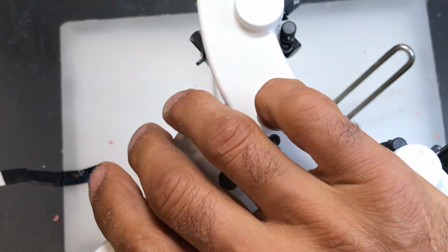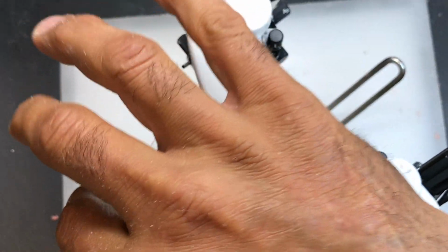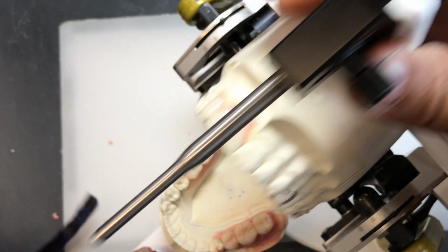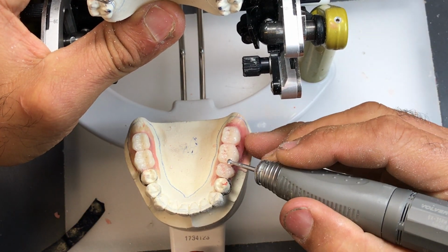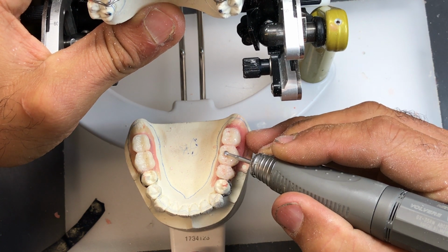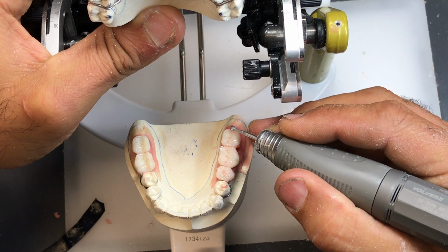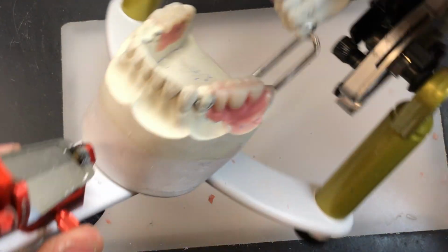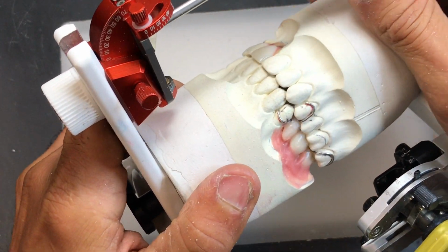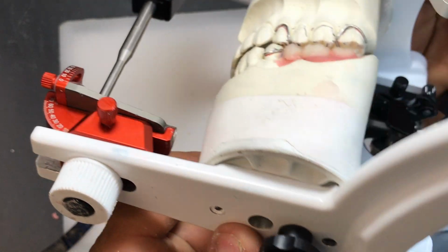Very close. I can almost hear the pin wanting to come together. If I tap it hard enough, I can hear it, but it's not there yet. Mostly here, that little spot there. Now let's see that. Definitely. So now I'm back to where I started. So I got nice centric contact.